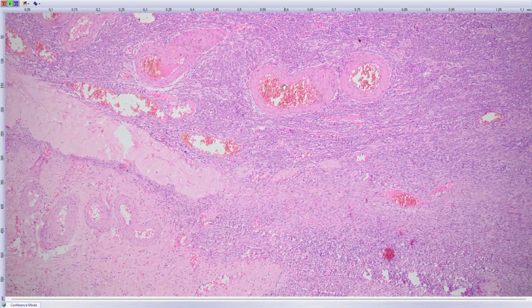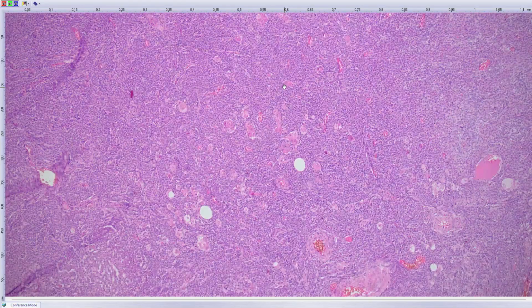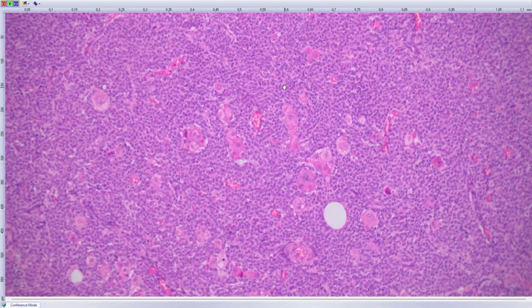Maybe have a second slide. Yeah. What are these cells? Do you see eosinophilic cells here? Yeah? When you make albumin staining, it's positive. Yeah. Sometimes you see even bile in it. It's hepatoid, not hepatoid, it's hepatic differentiation in granulosa cell tumor.